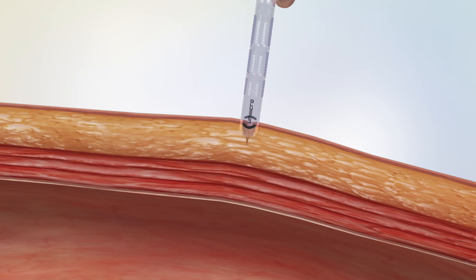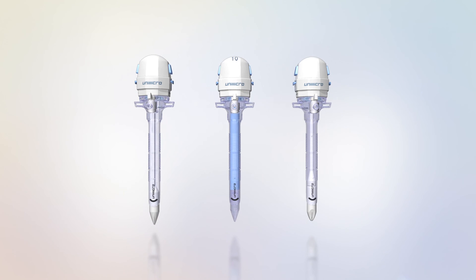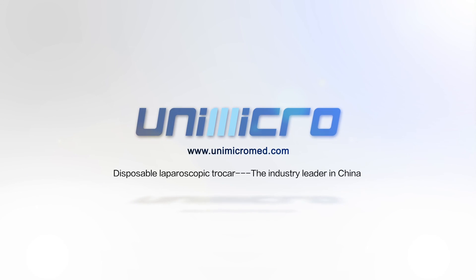Unimicro Trocar family includes visible, Hasson, and bloodless types with different diameters and working lengths, which could meet the customized requirements of different surgeries. For more information, please visit our website at www.unimicromed.com.